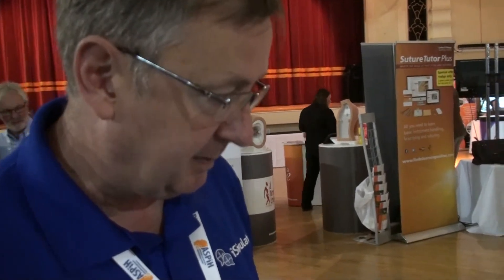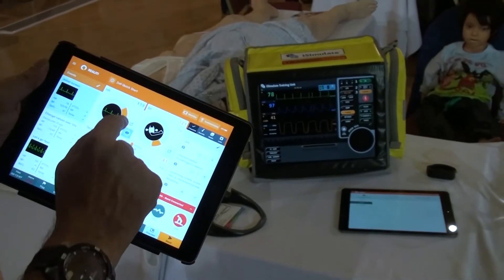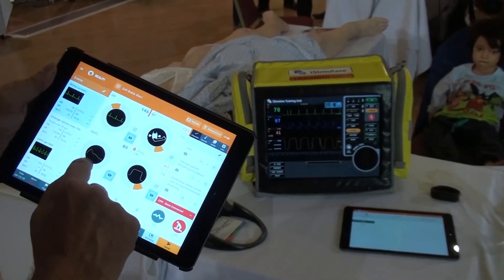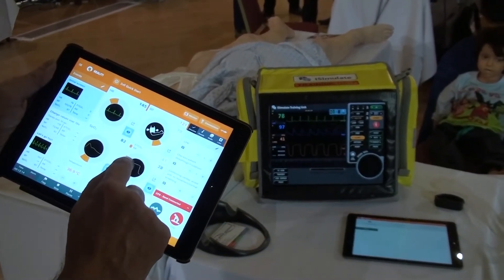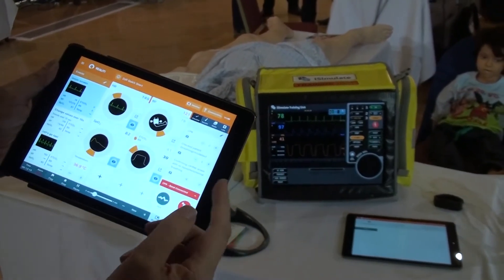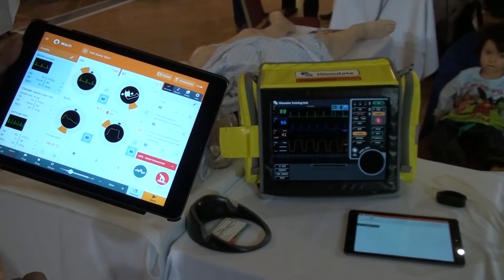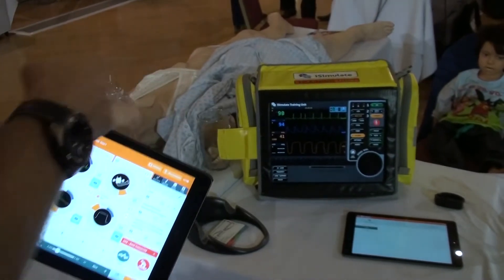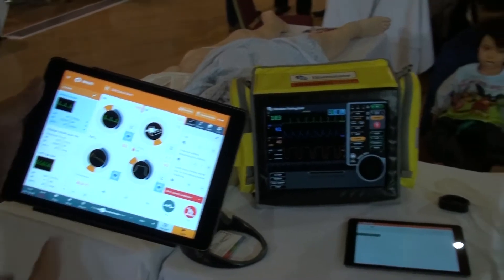Let's say I want to make the patient a little bit tachycardic, I want to desaturate them, and I want to increase the respiratory rate — just a few changes. I'm going to ask that to take 20 seconds. I push go and the patient will now become sick over that time. You can see that happening on the monitor interface as well as on the screen here.